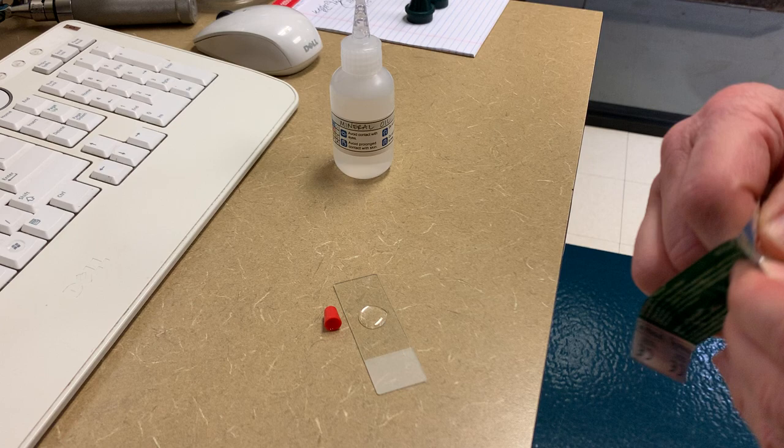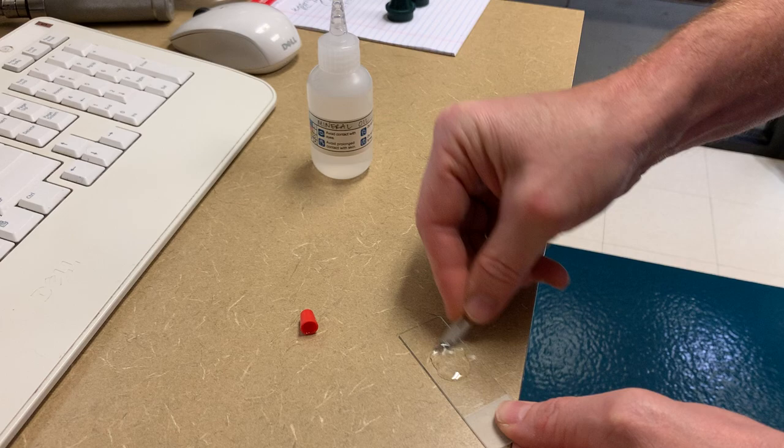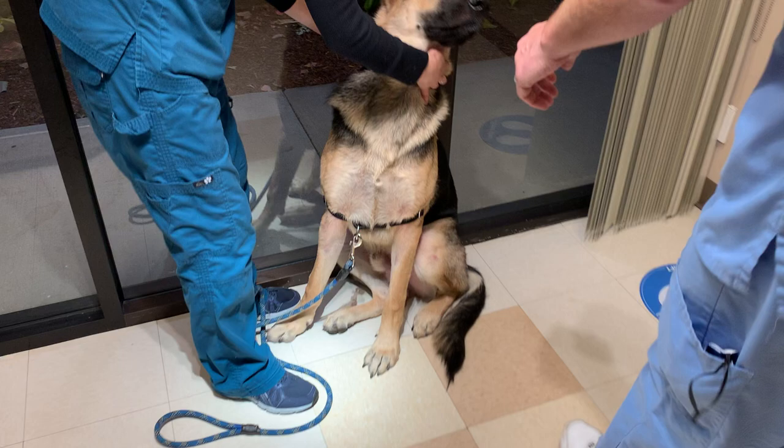This is a young itchy dog, so we'd be a little concerned about sarcoptic mange. I like to kind of dull the scalpel blade a little bit and slather it with a little mineral oil. We'll move over to the puppy over here and we want to cover kind of a broad area.